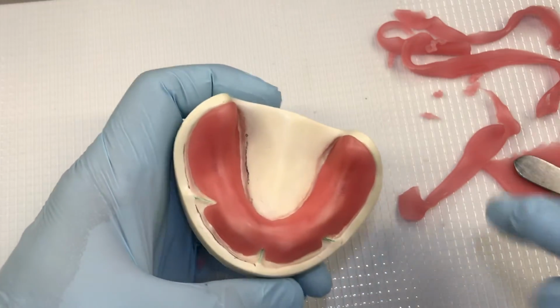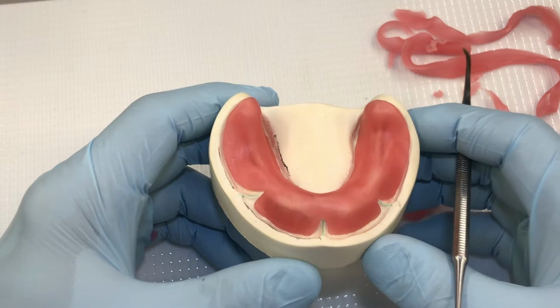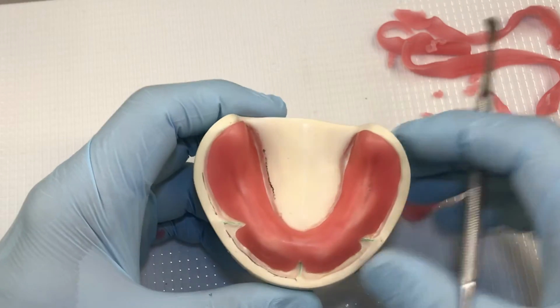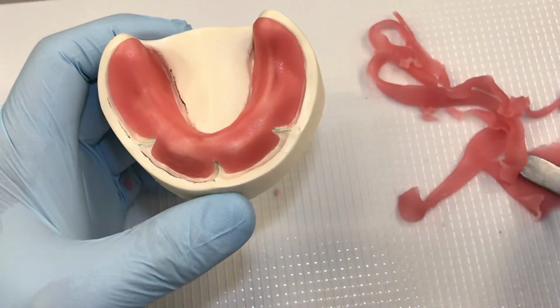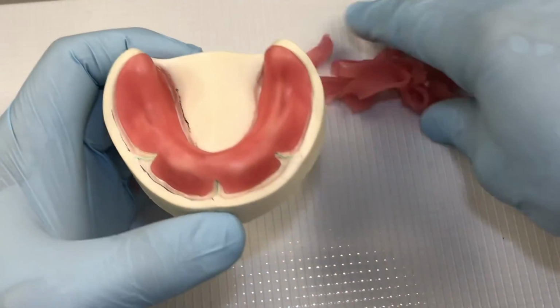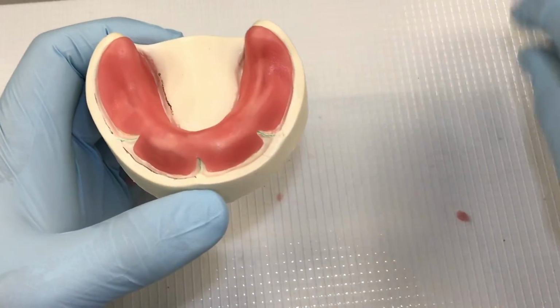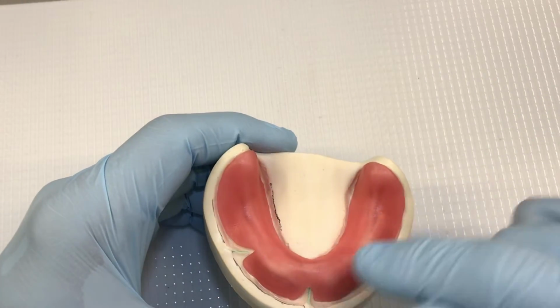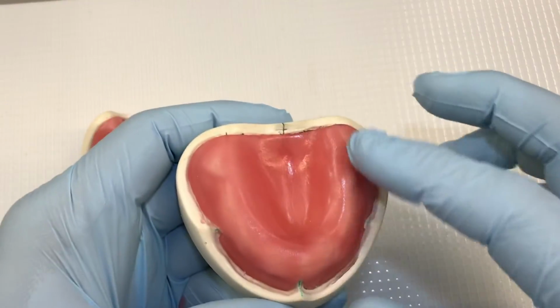So I'm going to put this back in the light cure unit for 2 minutes, let it cure, remove it, put it back in upside down for another 30 seconds. And once we've done that, we're going to boil off the block out wax, and readapt the base plates back onto the master cast so we can move on to the next phase, which is applying the occlusal rim on the lower as well as the upper.